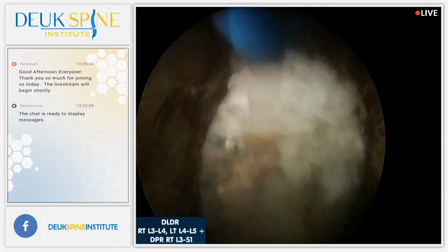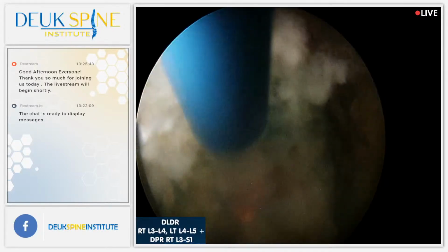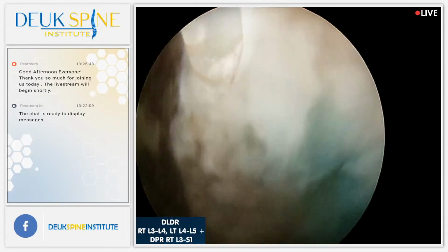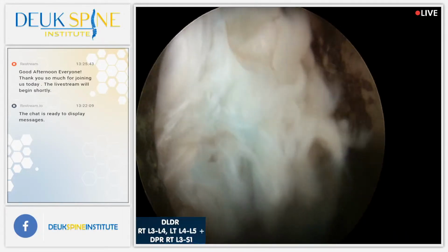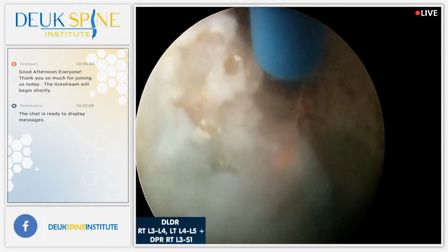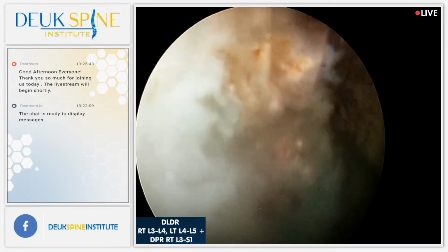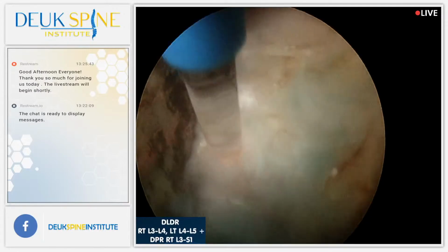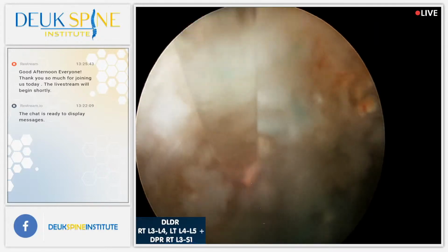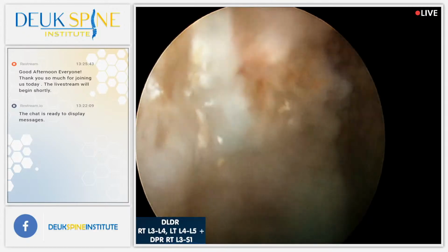We also can remove some bone spurs around the herniation if needed. We don't remove all the bone spurs. And as I've said many times before, we don't take the whole herniation out. It's not possible. There's the tear, by the way. You see the blue stuff? It really shows you where the tear is nicely. The blue stuff is the jelly in the center of the disc that has squeezed out into the tear and is sitting inside the tear, causing this pink stuff. You see the pinkish color there? Faint pink? That's all blood vessels, inflammatory blood vessels within the annular tear. That's where all the pain comes from.